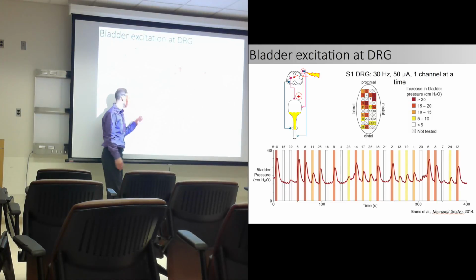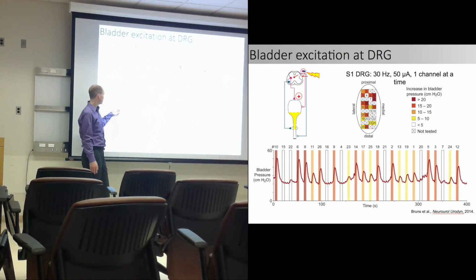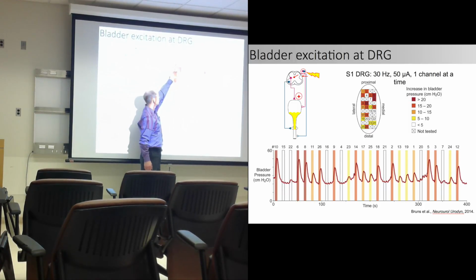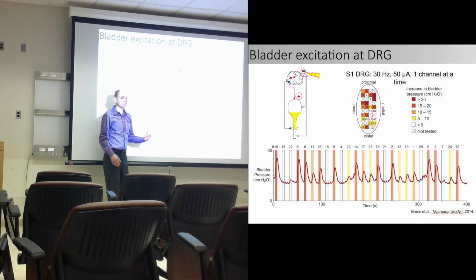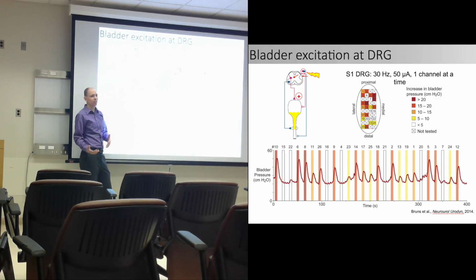So a couple of things in this case. Yes, we can get pretty robust bladder contraction during short stimulation. The other thing is that this is pretty selective stimulation, in that firing one location was not just blasting the entire root. In cases like electrode number 4, where stimulation nearby, the bladder contraction is not at that location. This suggests we can get pretty selective stimulation of pathways and not necessarily target unwanted responses.